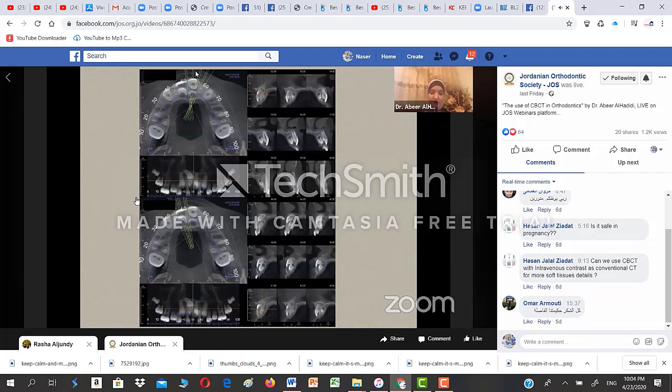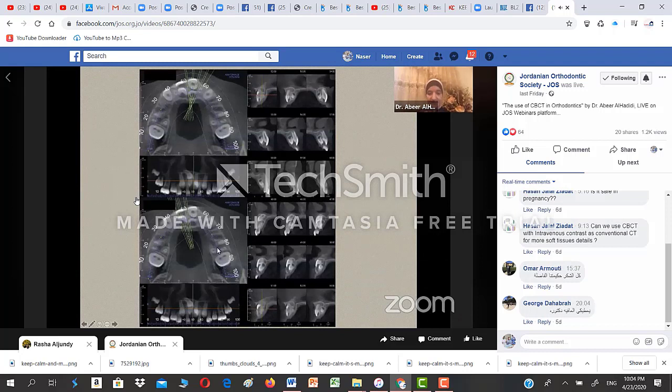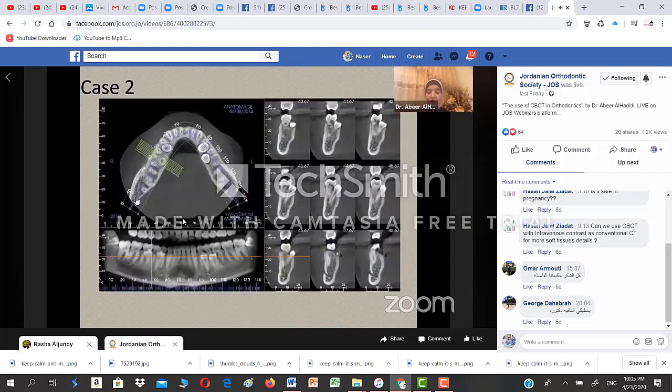And so if you see, the upper one is looking at the upper left central and the associated supernumerary, and we can see below the same representation of the supernumerary on the right-hand side. We see a couple of supernumeraries on the mandible as well, with the mandible having the IAN canal and the mental foramen. Also, relationship to vital structures comes in handy because, after we decide whether these teeth are to stay or to go, we'll probably want to look into the surgical approach, whether a different surgical technique needs to happen, whether that patient may need more than local anesthesia during the operation.